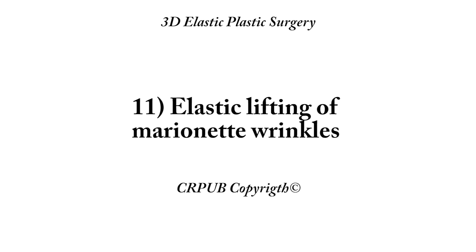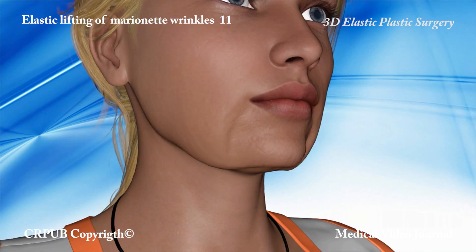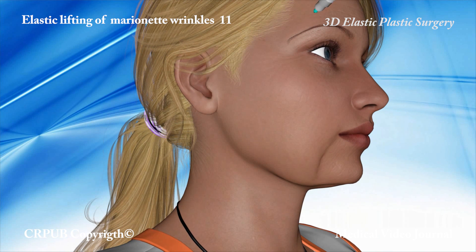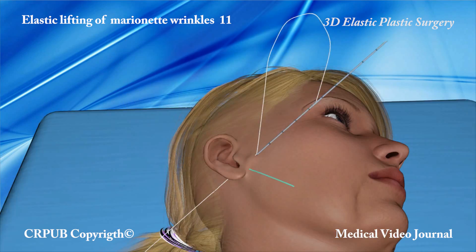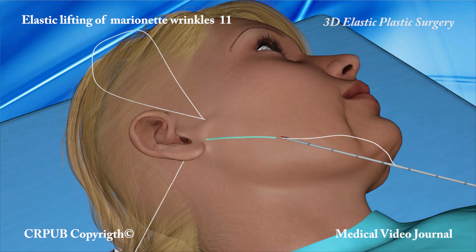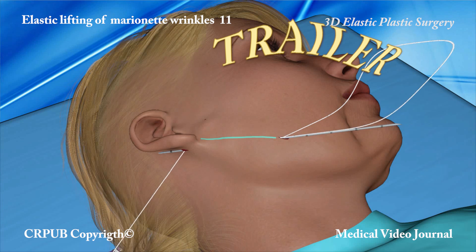Elastic lifting of marionette wrinkles. Marionette wrinkles can be corrected by exerting oblique traction by means of the elastic thread mounted on the atraumatic two-tipped needle. The Jano needle partially emerges at the pre-established point of traction and then returns to emerge from the incision.